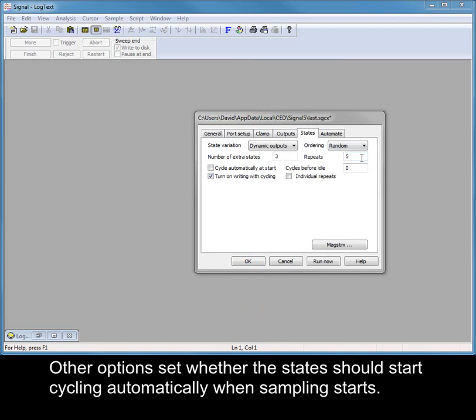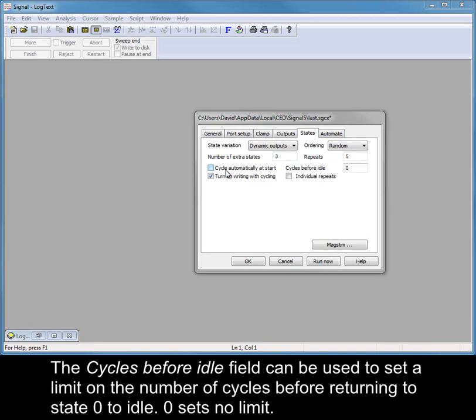Other options set whether the states should start cycling automatically when sampling starts. The cycles before idle field can be used to set a limit on the number of cycles before returning to state 0 to idle. Zero sets no limit.